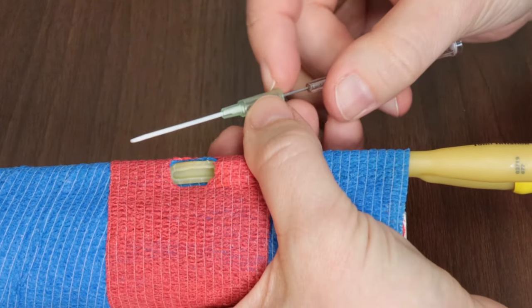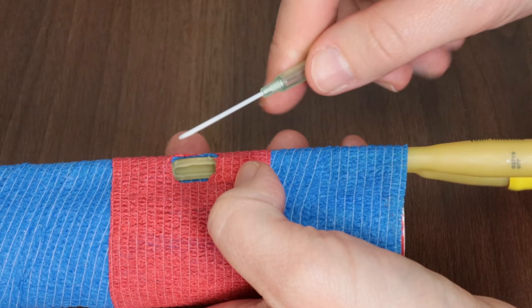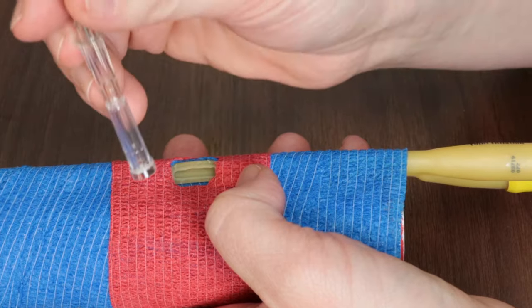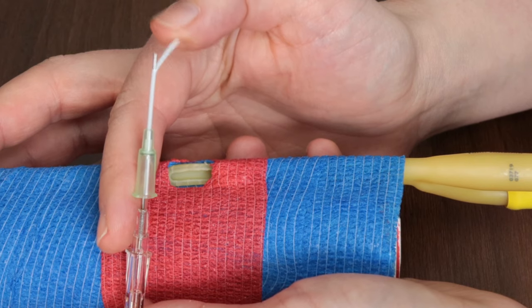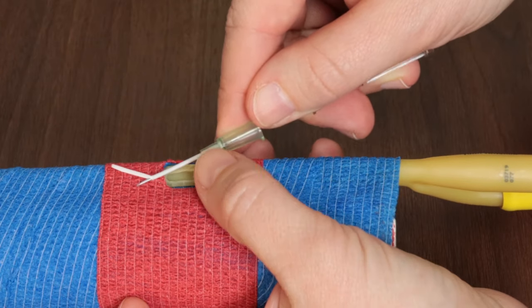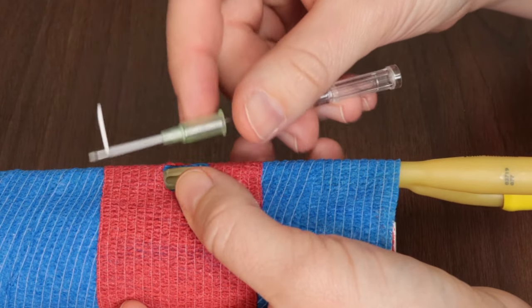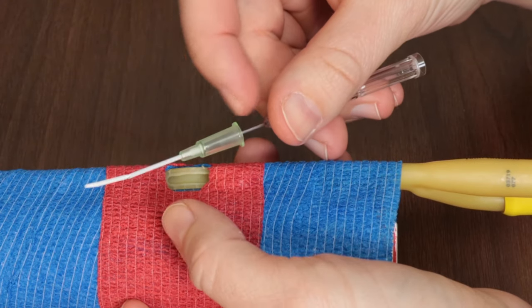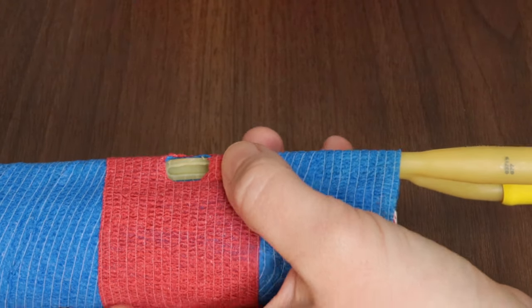And I'll show you why here. I pre-broke this one so you guys could see it here. So when we have our catheter wedged up and our sharp stylet coming through, again, we talked about that pliable material. See how that stylet stabbed very easy through that IV catheter. Now we run the risk, since this is all in our patient, of this dislodging and being stuck in our patient. So if we're in a situation where we need to get the catheter back on, always pull your catheter back towards your stylet rather than the other way around.